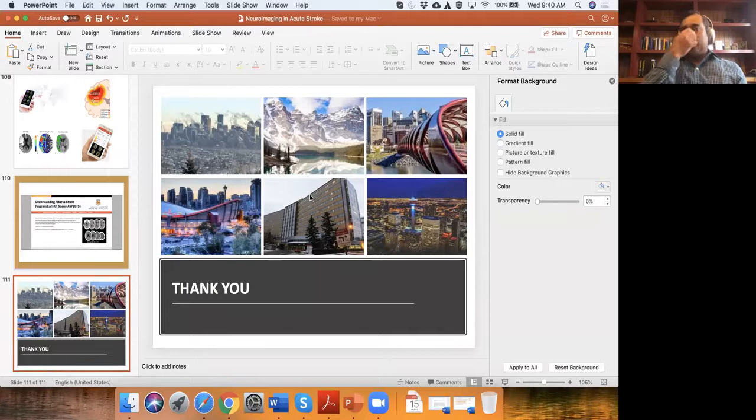Now, as I showed you, one way of distinguishing it from a true occlusion is to look for other signs. If you see a lot of calcification, and you look at the axial images, and you can potentially see a plaque-looking appearance, then you can say there is a plaque there too. So it's not purely pseudo occlusion, there is a real occlusion there. But there was the other imaging appearance in the Dutch paper, where instead of a shoulder effect or a flame effect, you actually see a regular effect. So the contrast is stopped, but there is a distinct grayish zone that you can see. And that type of appearance could actually be seen with pseudo occlusions.